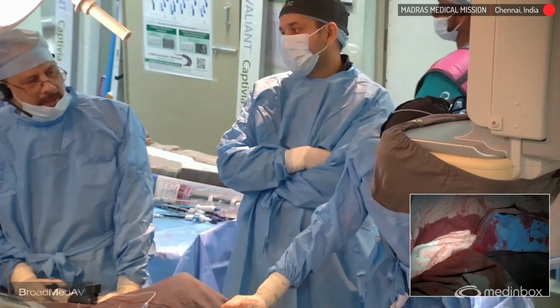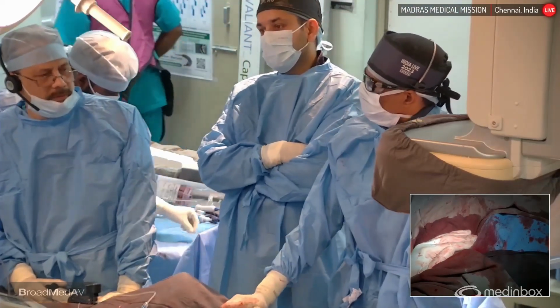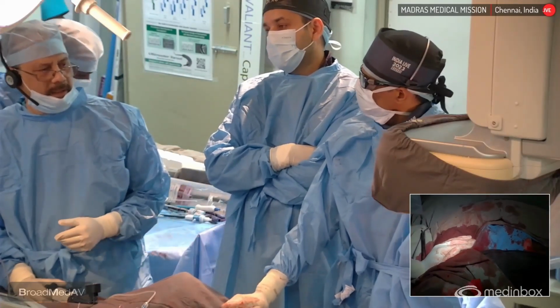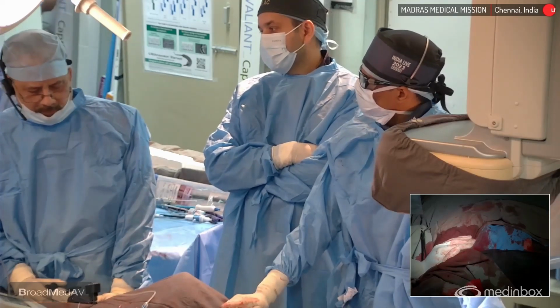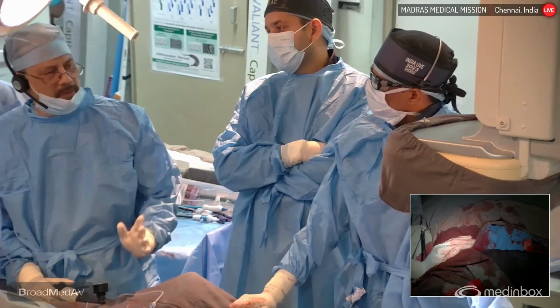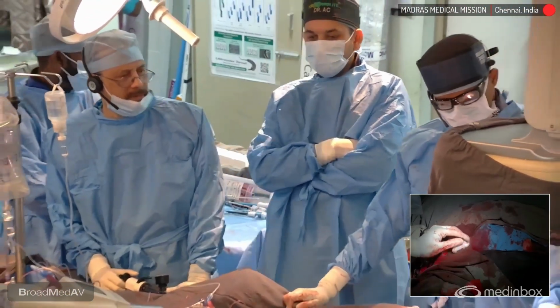If at all it is not getting settled, what is your next option, regarding covered stent across the joint, sir? That is a little bit of concern. It's a no stent zone, common femoral artery. When you place a stent, when he flexes his hip joint, it can get crushed. So you'll have to think twice. Or else the other option of surgical closure is also there. We can always ask the surgeon to close the rent for us.